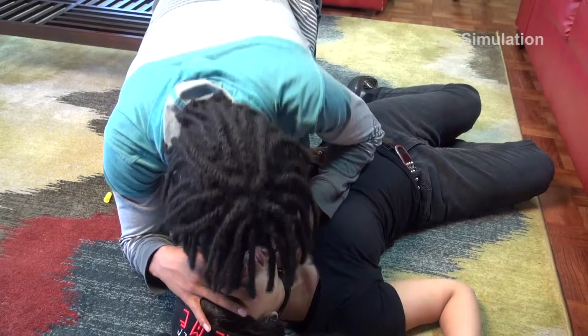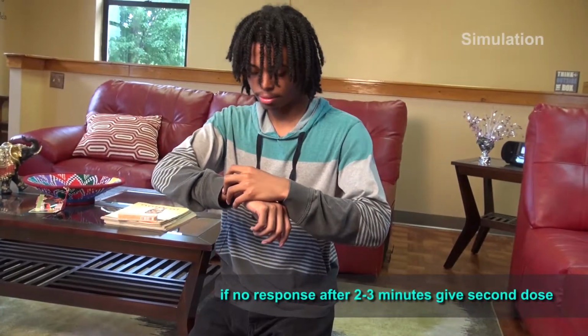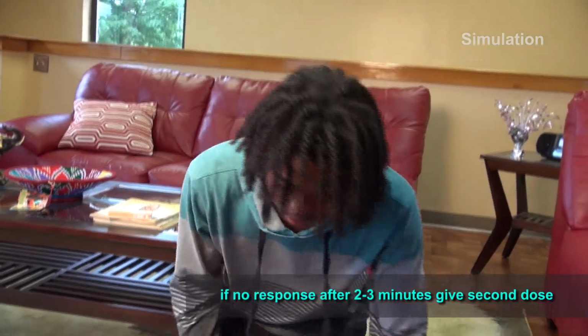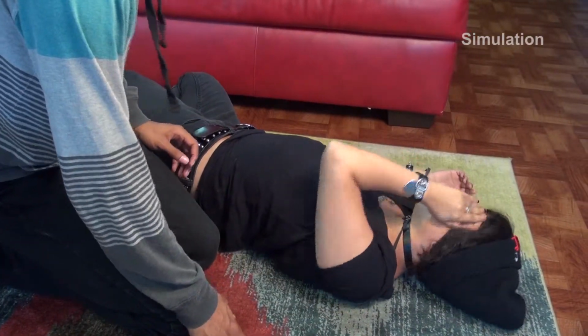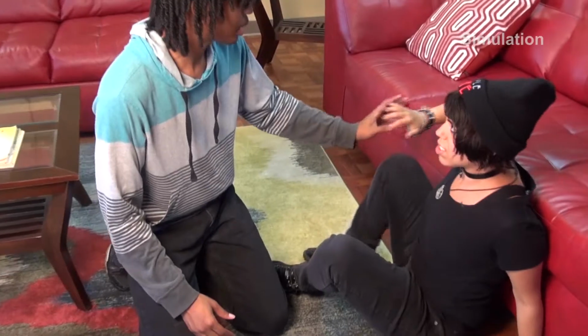It may take a minute or 2 to work. In the meantime, you need to continue with the rescue breathing. If the person does not respond within about 2 or 3 minutes, you should give a second dose. When people are revived, they may be confused, upset, or even agitated. Actual combativeness is reported only about 1% of the time.